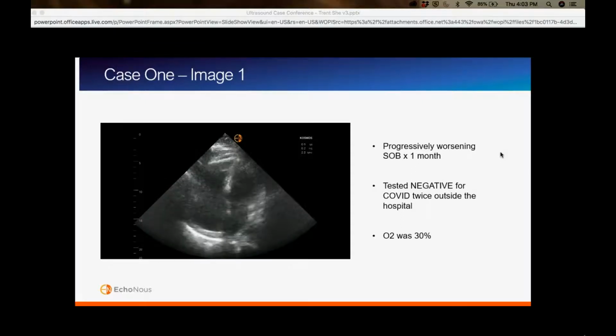And so what we started to do was our bedside cardiac echo, with shortness of breath as the indication. In this image that you see here, this is an apical 4-chamber view where you're trying to see all 4 chambers of the heart. The biggest thing that I'm looking at here is the right ventricle size versus the left ventricle, but there's of course a couple other things that I could be looking at: presence of pericardial effusion, left ventricle systolic function, and of course presence of cardiac activity. It was a patient in really profound hypoxia that I'm leading this to. And this is the image that I obtained from that patient.